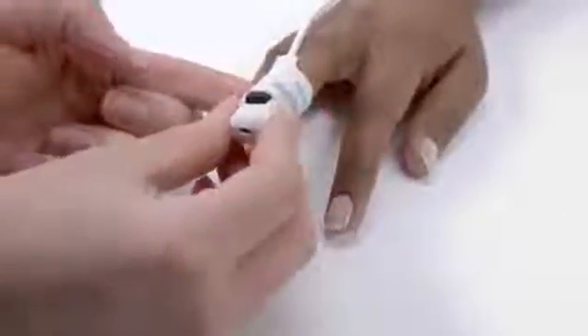The pulse strength signal bar in the center indicates the signal quality. Green bars indicate a strong reading, amber indicates a marginal reading, and red indicates a low reading. It's a good idea to check pulse signal quality at start-up and adjust the sensor for a stronger reading if necessary.